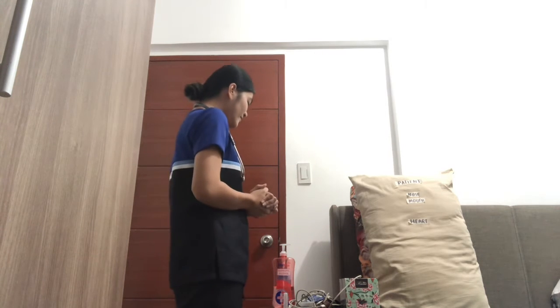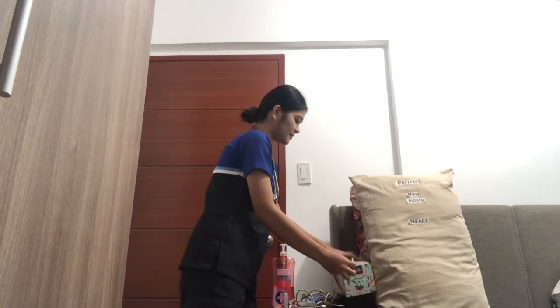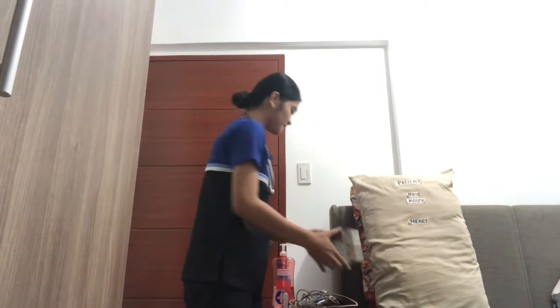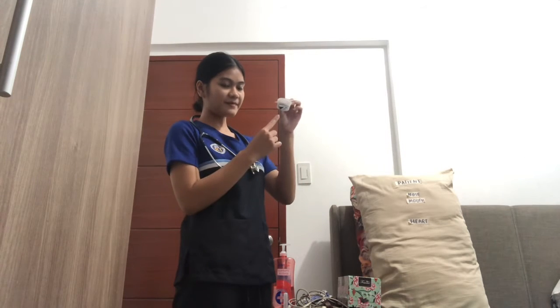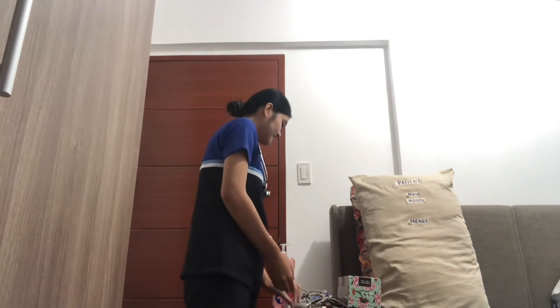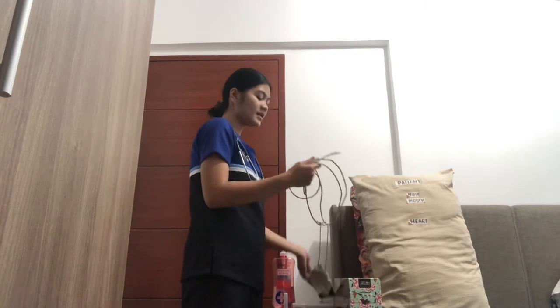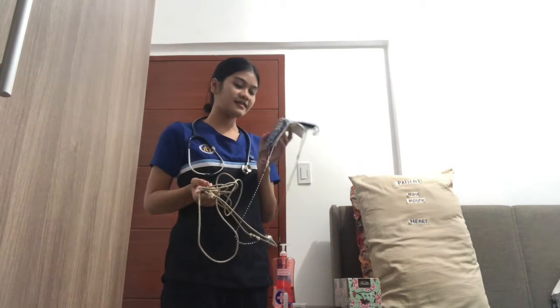After that, we will now gather the other required equipments for nebulization. So, we have here a nebulizer compressor, a chamber with a baffle inside, a connecting tubing, as well as the face mask.